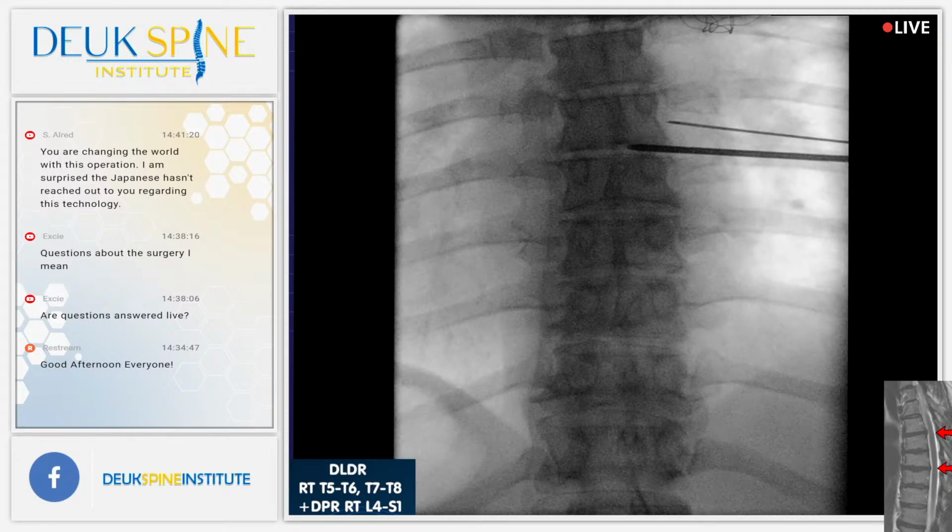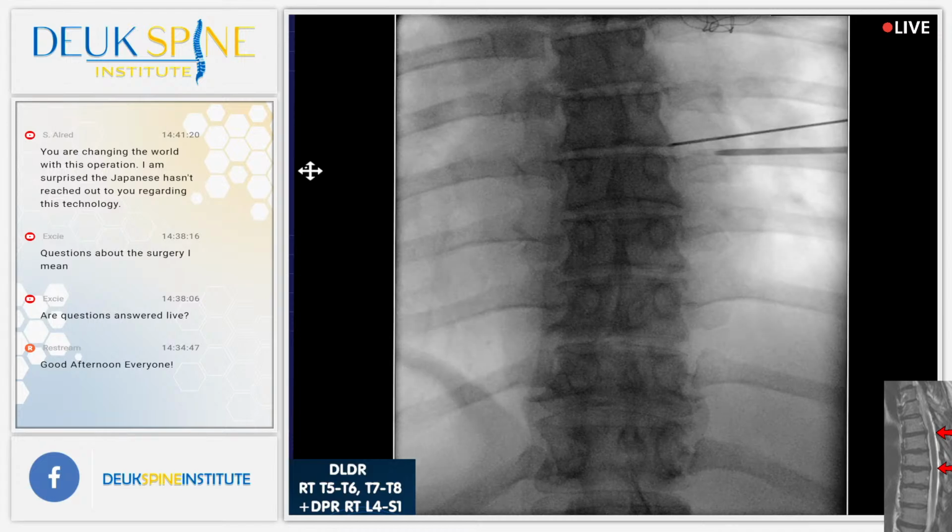Shot. All right, we need to go a little further south. Where do you feel that? Let's go with a lateral view. Where do you feel that in your upper back? Okay, all right, I'll give you some numbing medicine.